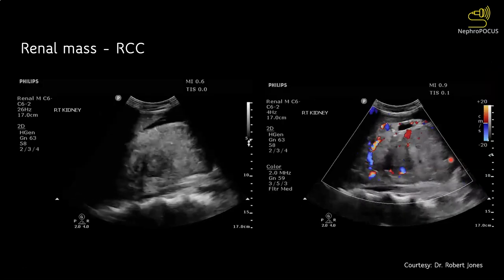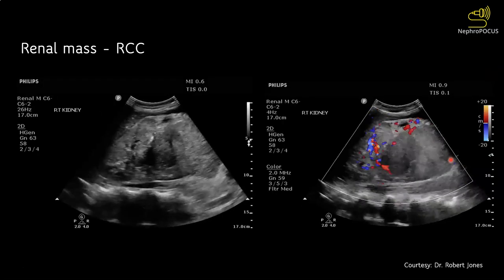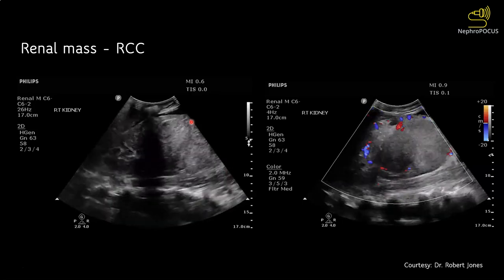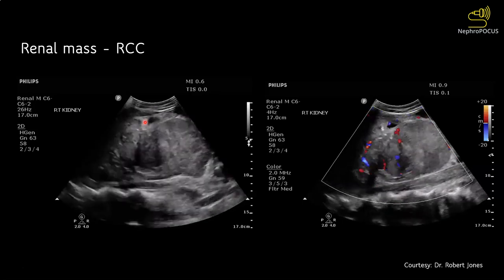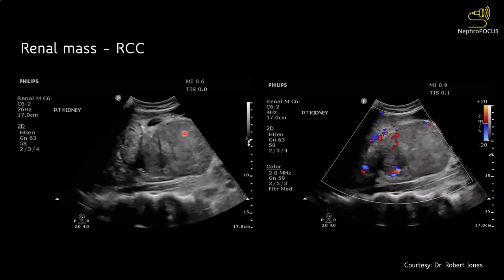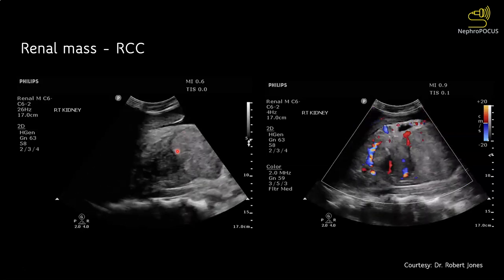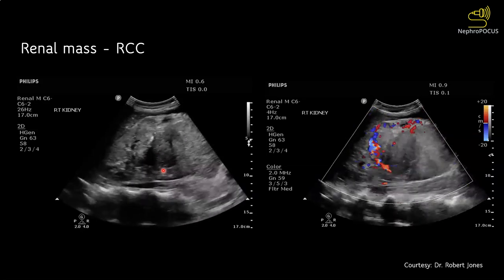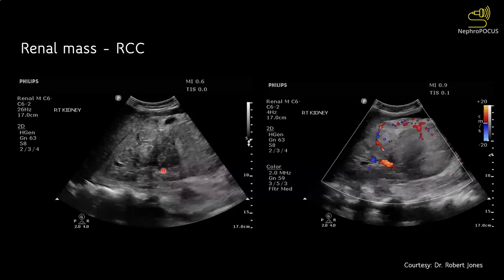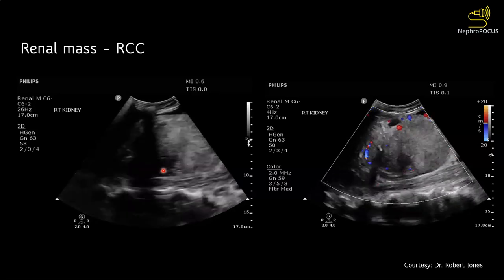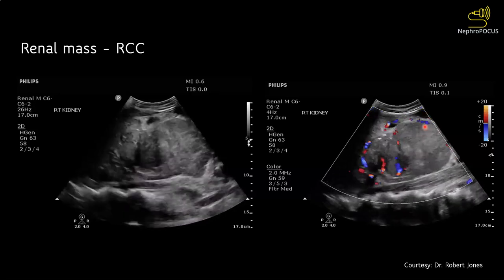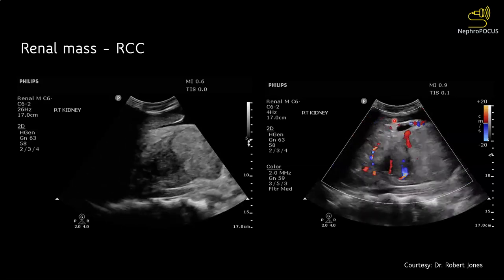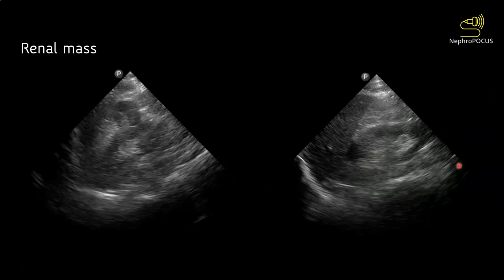Here is another example of a large renal cell carcinoma occupying more than half of the kidney — it is very heterogeneous in echogenicity. This anechoic or hypoechoic area likely corresponds to tumor necrosis. Here is the color Doppler image showing the peripheral distribution of the blood supply.